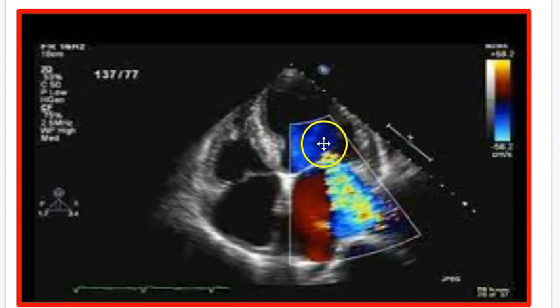So with this, you can see here that our blood regurgitant jets coming down from the LV into the LA, actually up. We're just upside down in echo. And this blood here is hard for the machine to determine which direction it's going, but we know it's kind of going in this direction, and we can see our scale here that it's going away from us, and therefore it's going to be lighter blue, and it's going to alias because it's going too fast for the machine to determine which direction it's going in. Therefore, it's going to turn that cyan, sort of a yellow color, if you will.